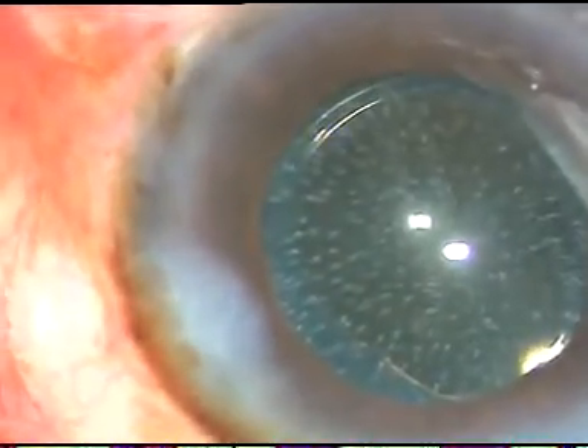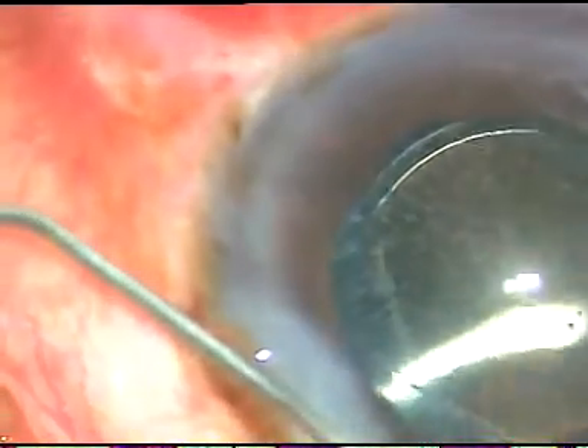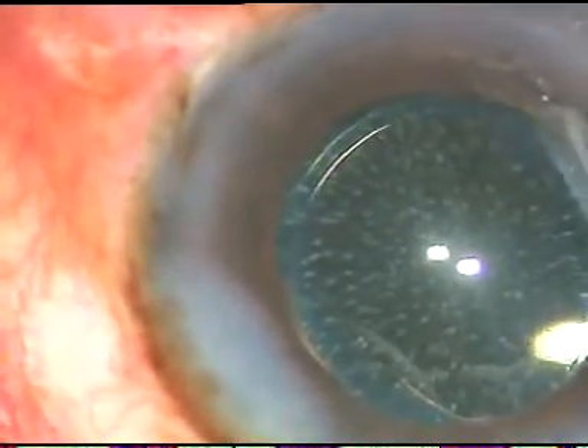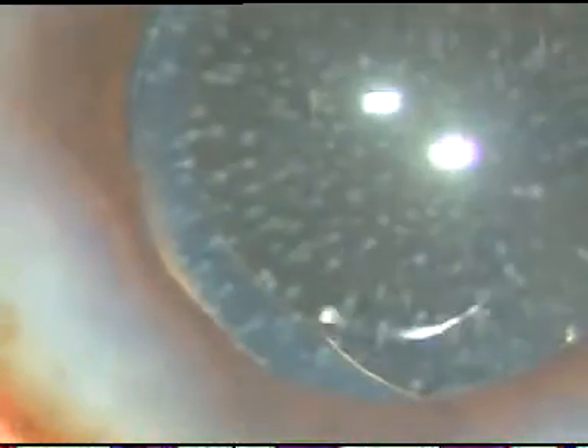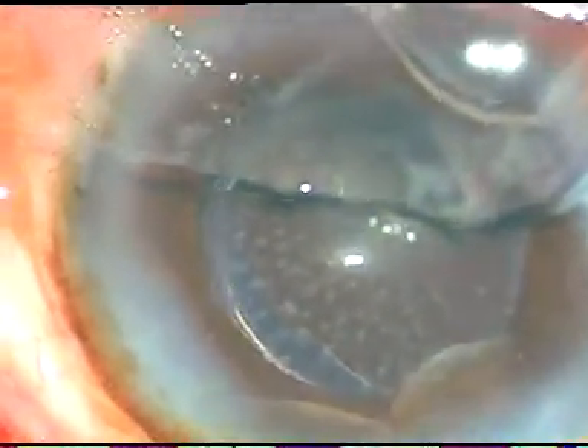The side ports are hydrated and the anterior chamber is formed and the case is concluded. Dear colleagues, we must take all challenging cases as fun, as very interesting. We must not be afraid of any challenge in surgery, because there is a way. In 99% of challenging cases there is a way, and you just have to find that way to complete the case. Thank you very much for watching. Hope this video will help you in developing your surgical skills. This is a real-time surgery.